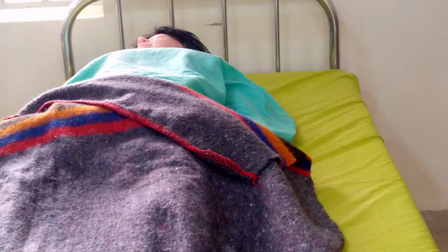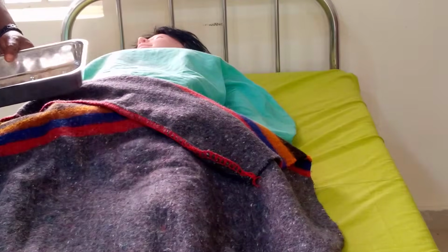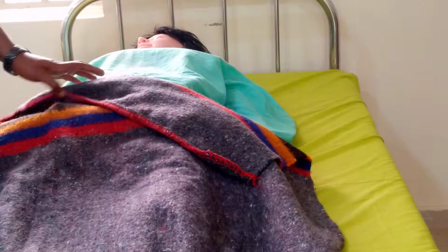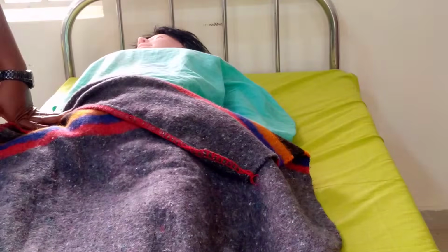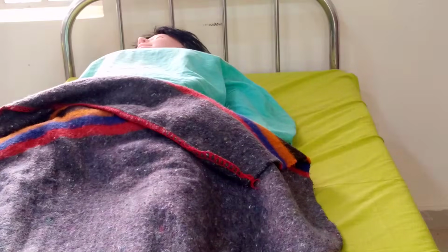So for abdominal examination of a pregnant woman, the materials we need are just the tape rule and the pinard stethoscope. Okay. So first of all, you explain the procedure to the woman in order for you to gain consent, and also gain her cooperation. Then you tell her to go and empty her bladder, so as to prevent any discomfort by the time you start palpating, especially at the pelvic region.